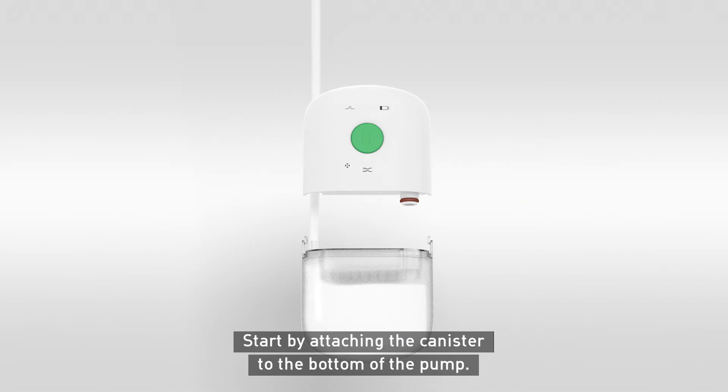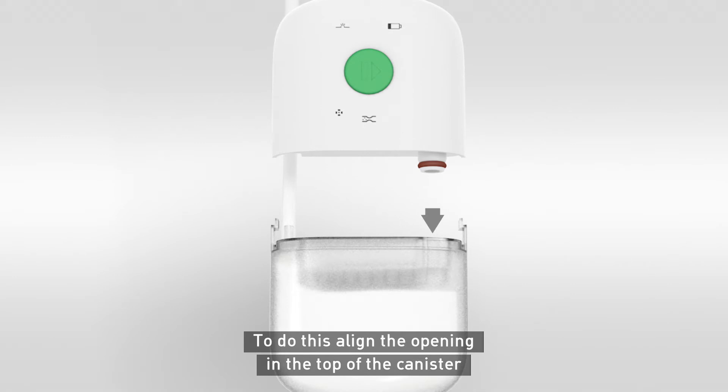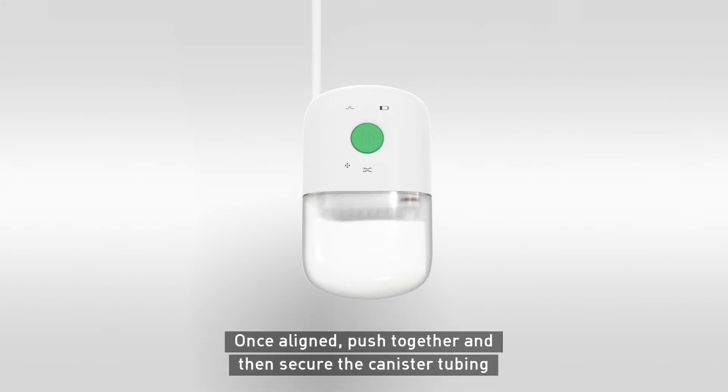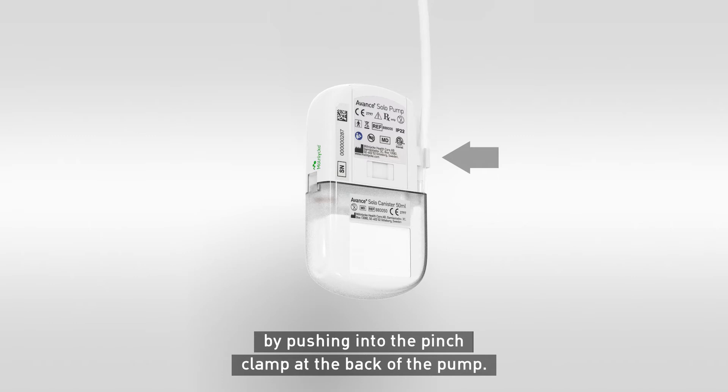Start by attaching the canister to the bottom of the pump. To do this, align the opening in the top of the canister with the spigot projecting from the bottom of the pump. Once aligned, push together and then secure the canister tubing by pushing into the pinch clamp at the back of the pump.